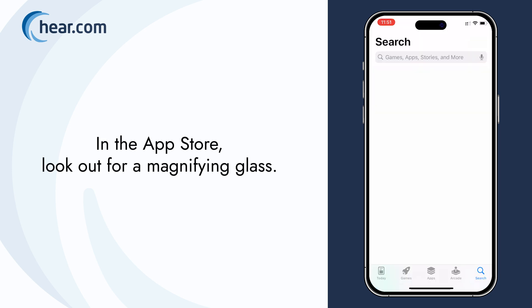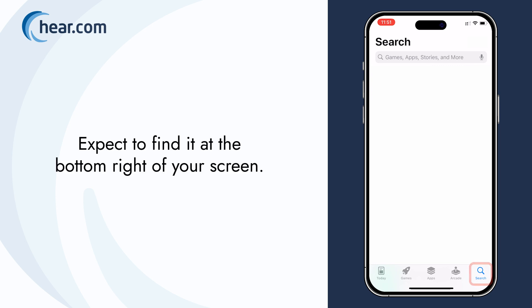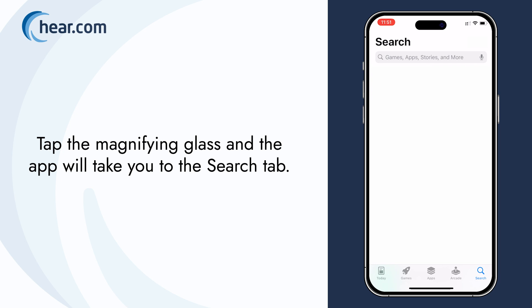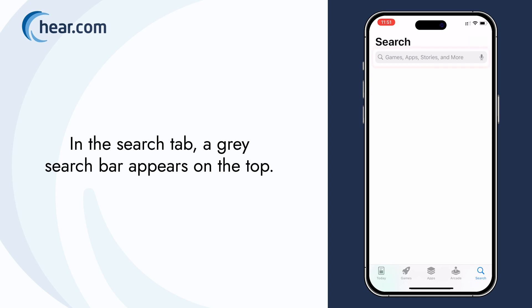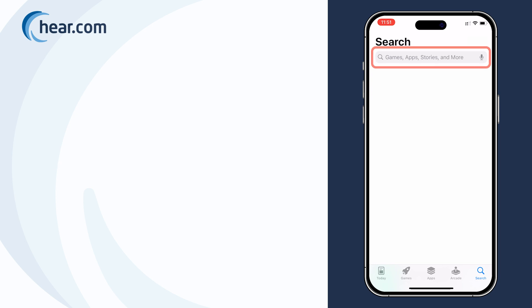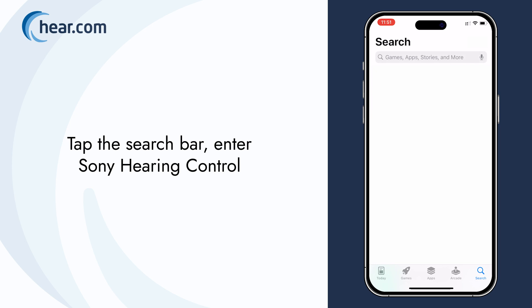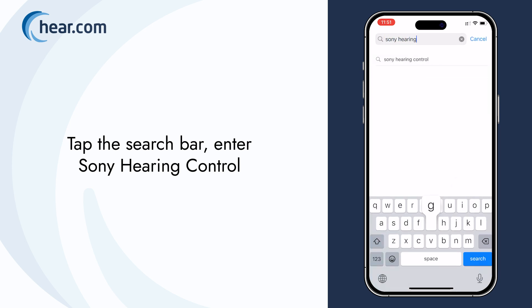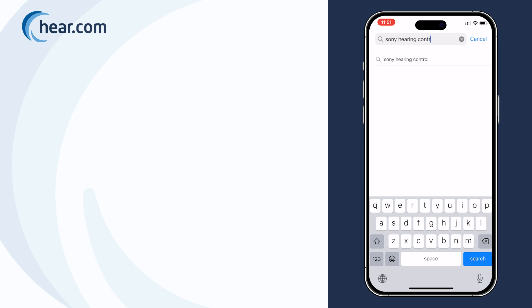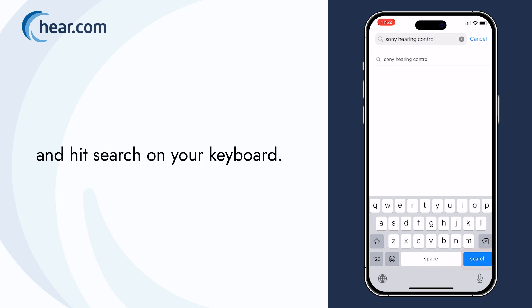In the App Store, look out for a magnifying glass. Expect to find it at the bottom right of your screen. Tap the magnifying glass and the app will take you to the Search tab. In the Search tab, a gray search bar appears on the top. Tap the search bar, enter Sony Hearing Control, and hit Search on your keyboard.